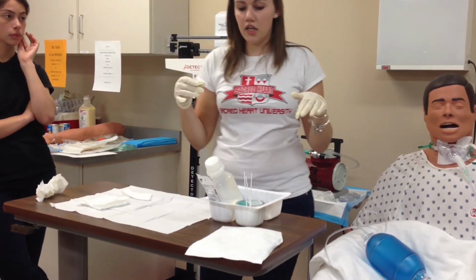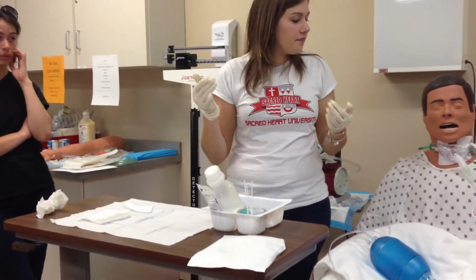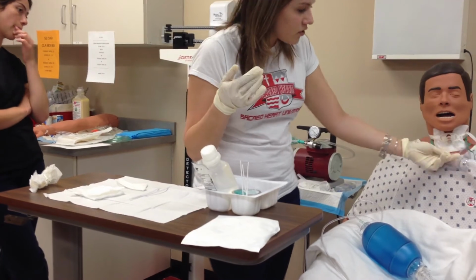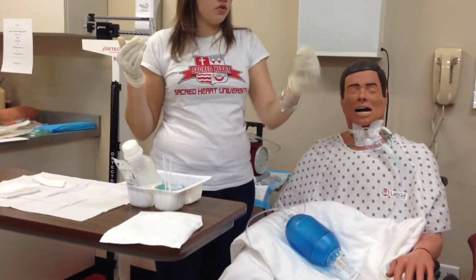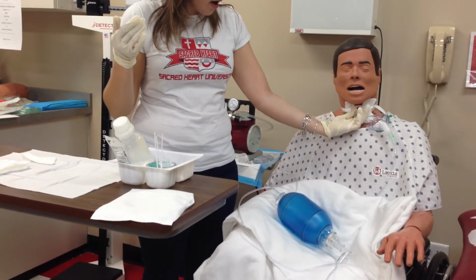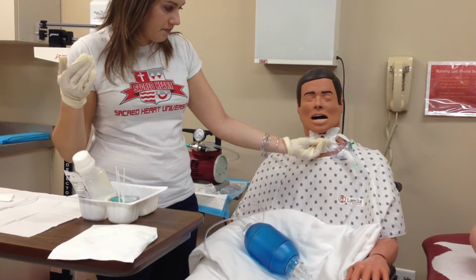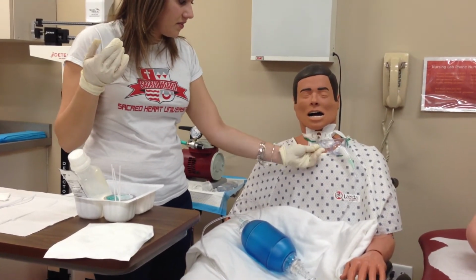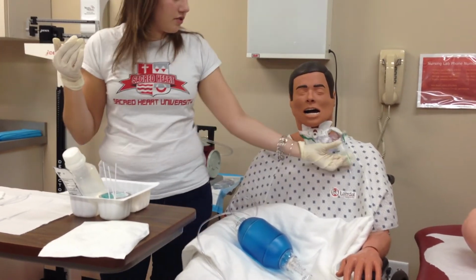The same thing with this. You're going to keep one hand dirty, one hand sterile for the most part. So you take this. The one that you should have on the practical is you just turn it to the right and it pulls right out. This one has things on both sides that you just squeeze in and then it pulls out. And just kind of twist it a little. And then drop it in the hydrogen peroxide.